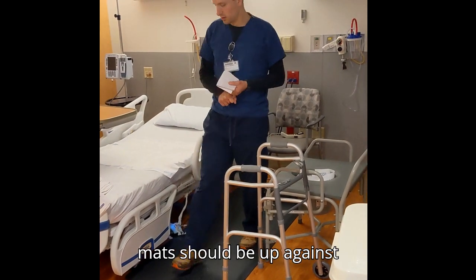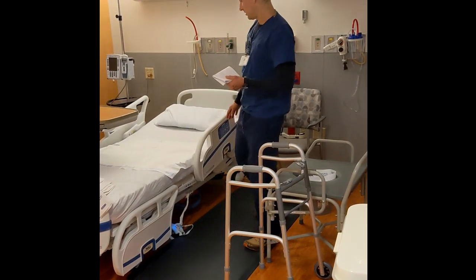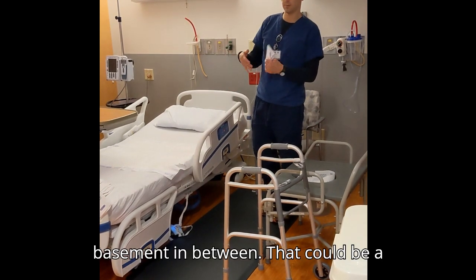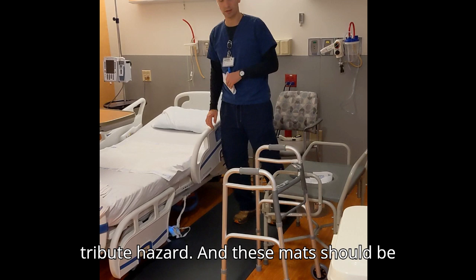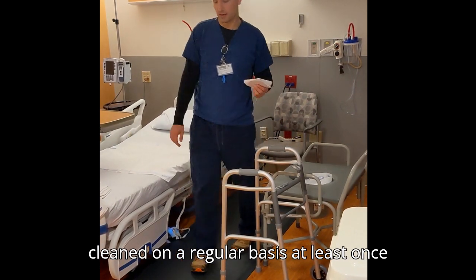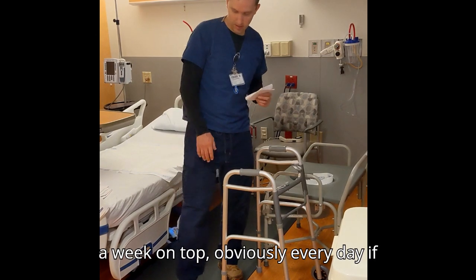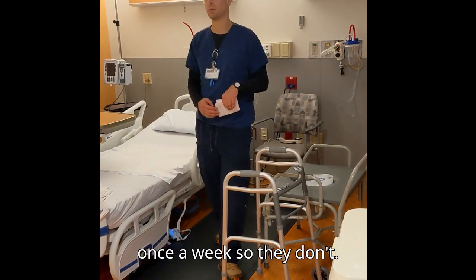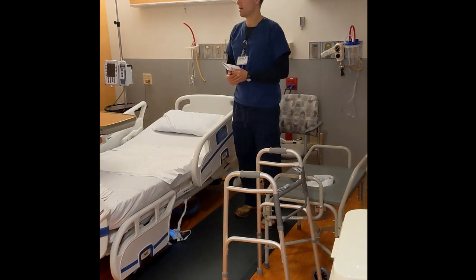These mats should be up against the bed, so there's no space in between that could be a tripping hazard. And these mats should be cleaned on a regular basis, at least once a week, on top obviously every day if possible, but then under the mat at least once a week so they don't end up sticking to the floor.